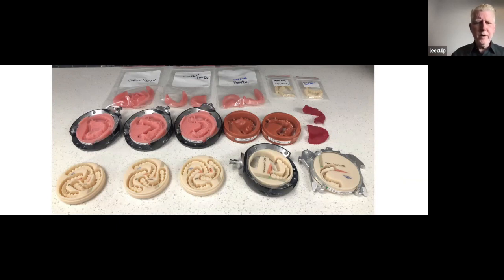The light pink ones are obviously milled base materials in the beginning. The really dark red ones are printed wax that we could still process. We've got many different ways to do teeth. And then on the back row, we had all the printing that we were testing, because we tested everything. And this is kind of back when it started.